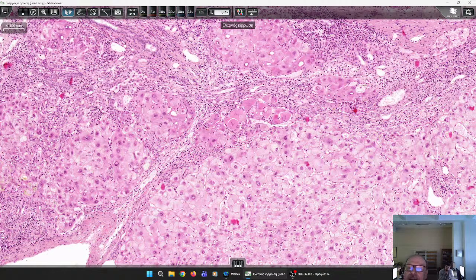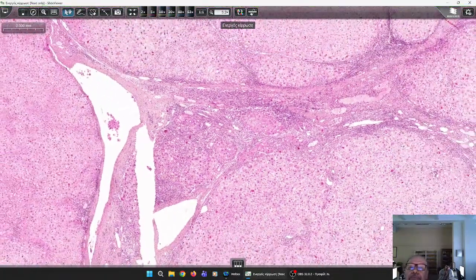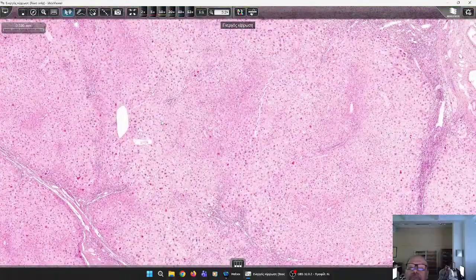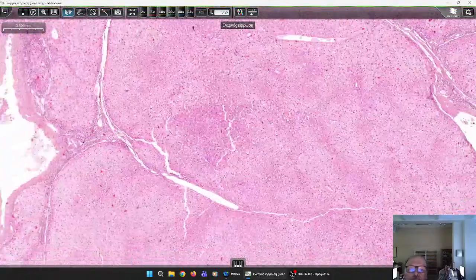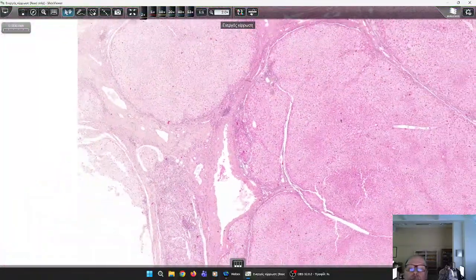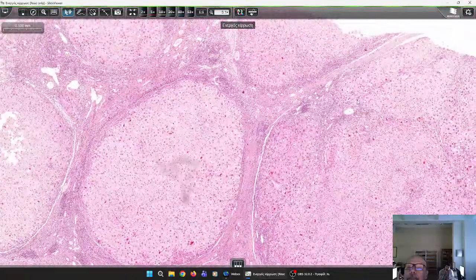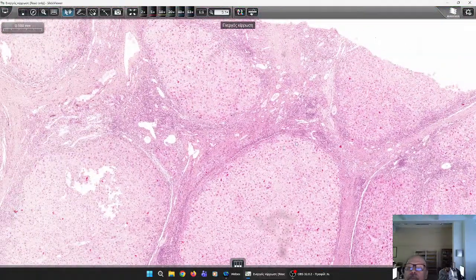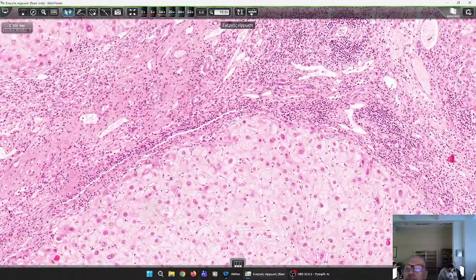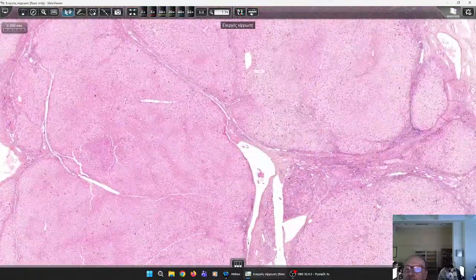But when you're talking about septa, look, here we have active cirrhosis, you see? They pass in the cirrhotic nodules, the inflammatory cells. Active. This is activity in cirrhosis. But when you say septa, you imply that, regardless of whether they are small or large in diameter, you are already at the cirrhotic stage. And you should know that we have many systems grading the cirrhosis, which take into consideration the diameter of the septa in relation to the diameter of the smallest nodule.